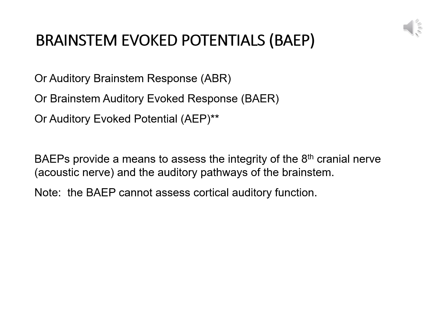They can also be called an AEP, or an auditory evoked potential, but it's important to note that the auditory evoked potential can refer to either the brainstem evoked potential or a cortical auditory evoked potential. And what we record clinically is only the brainstem response. And so it's important to differentiate the auditory evoked potential, whether it's a brainstem or a cortical, if one is asked just for an AEP.